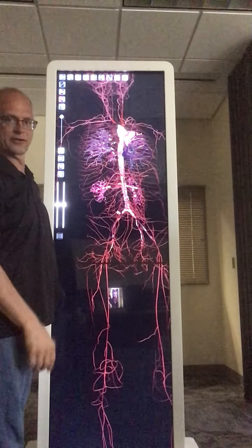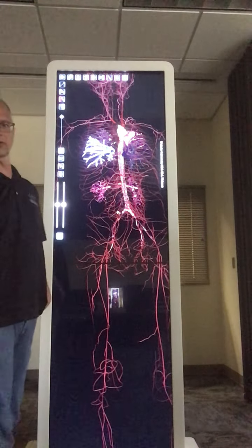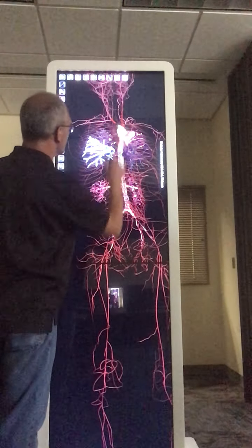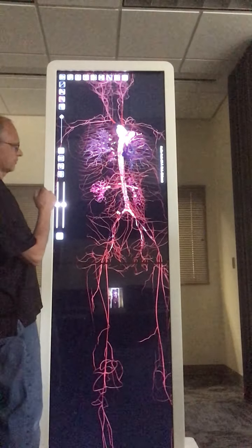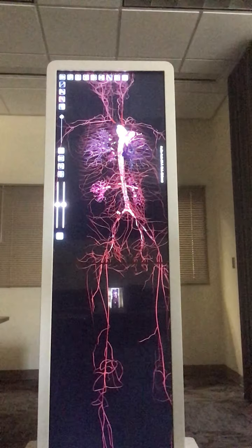I get rid of the heart. Oh, we got another vein there. And then look there, you can see that a little better. So it did not get rid of the aortic arch or the aorta. Okay, that ought to do it for just looking at arteries.